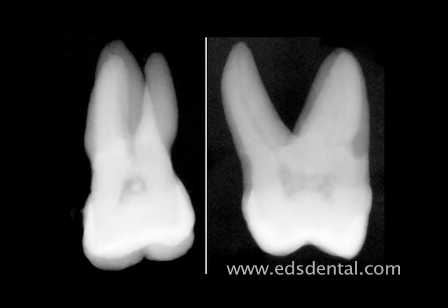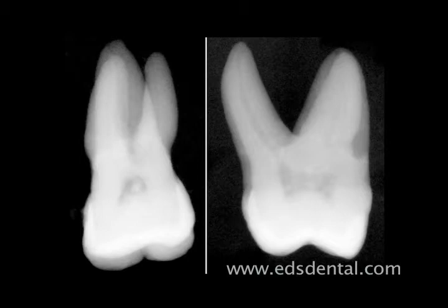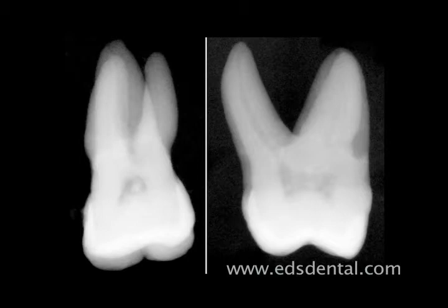I picked this extracted tooth because, as you can see from the X-rays taken buccolingually and mesiodistally, the chamber is quite calcified and has what appears to be a pulp stone taking up a good portion of the chamber.